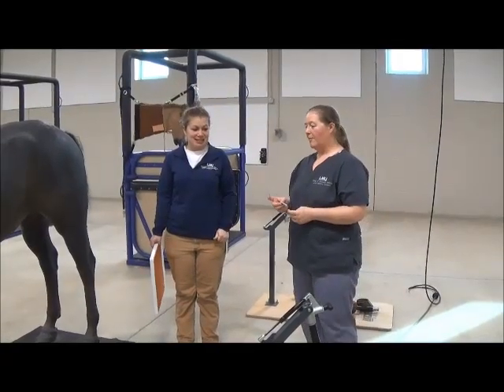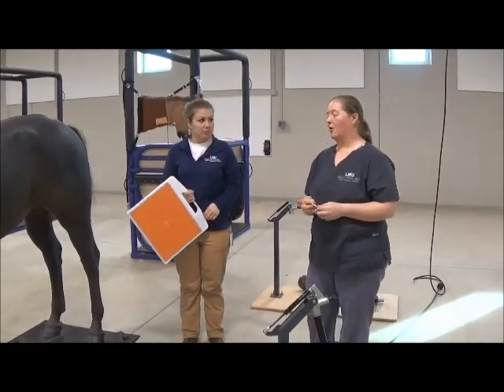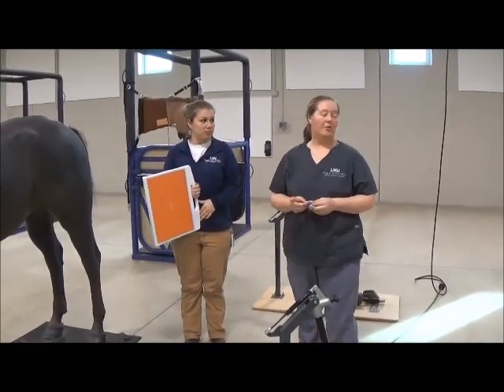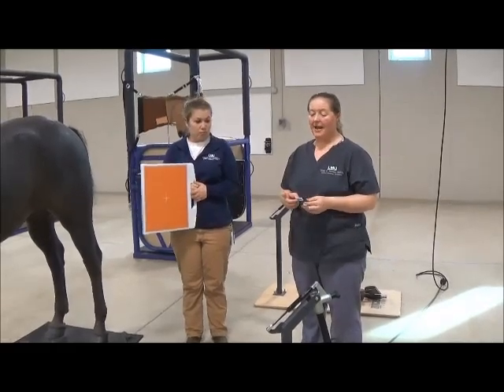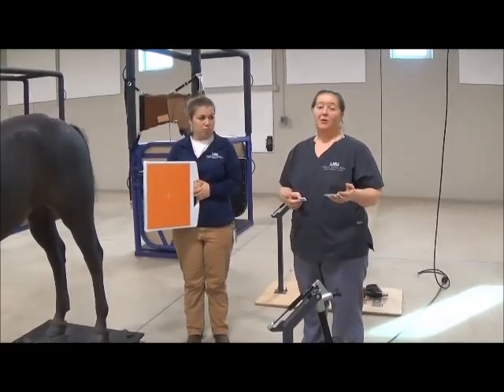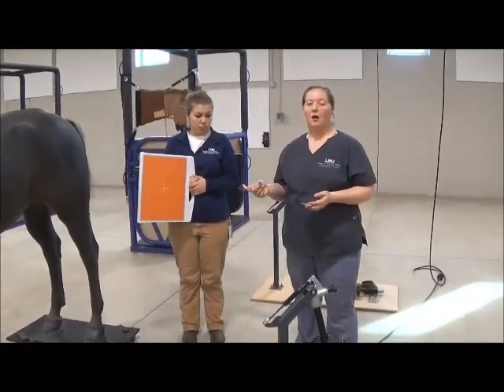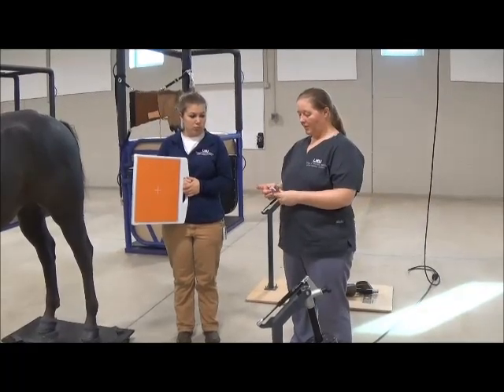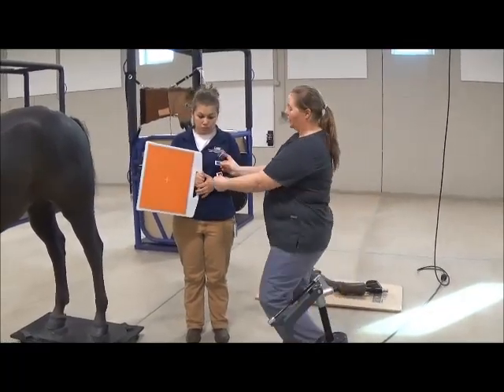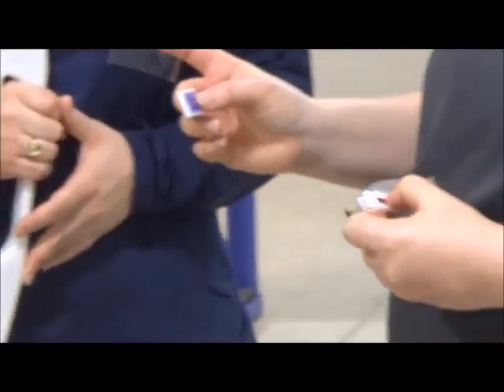Another important part about radiographing is making sure that you have proper markers placed. Even though with digital radiographs now the computer labels them for you, we still need to label them on the plate for medical record purposes. So first, you need to pick whether you do a right or a left. We're going to do a left behind here.